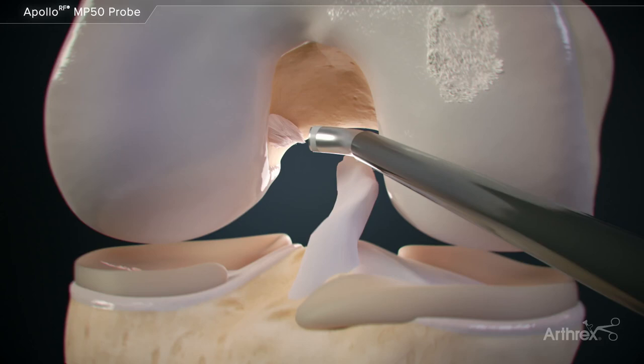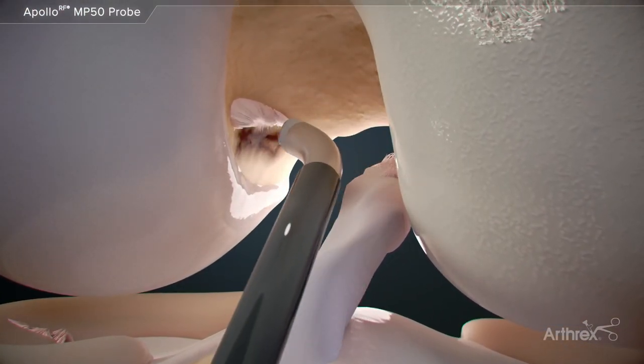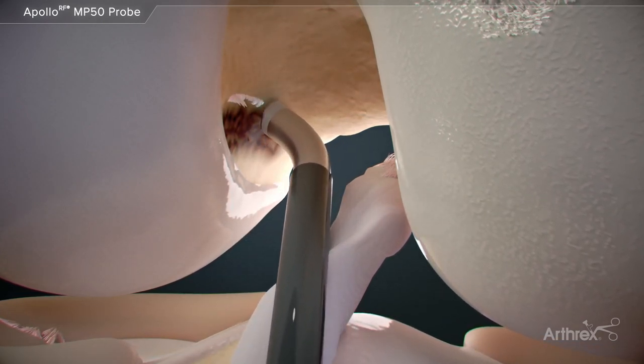The MP50 can be used to help prepare the femoral notch for notchplasty procedures and can be used to mark the ACL origin for reconstructive procedures.